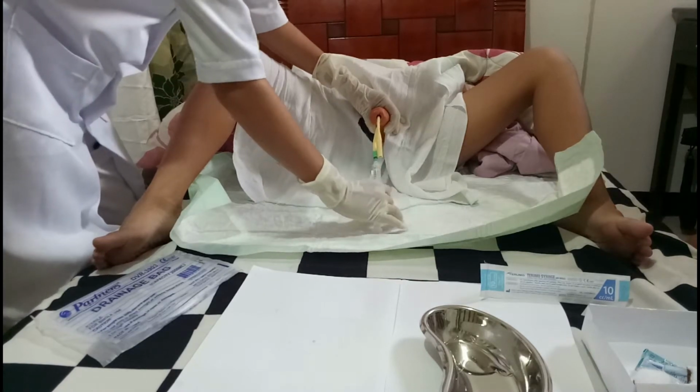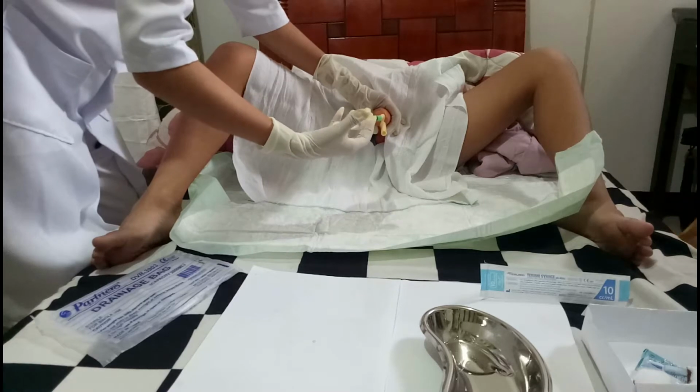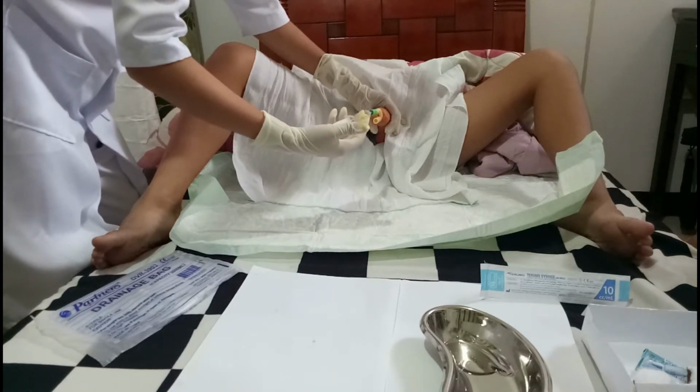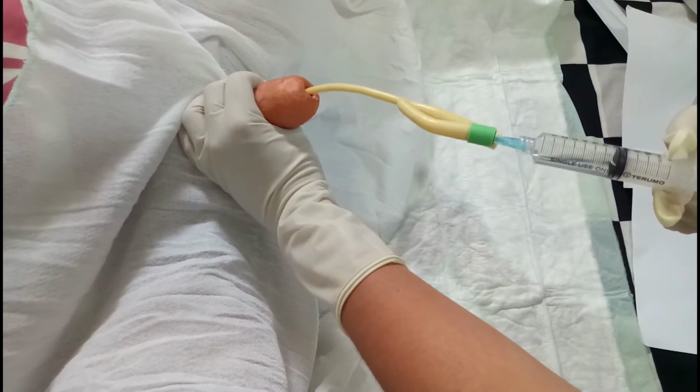And then, I'm going to inflate the balloon to secure the urinary catheter safely and to ensure that it won't be dislodged.